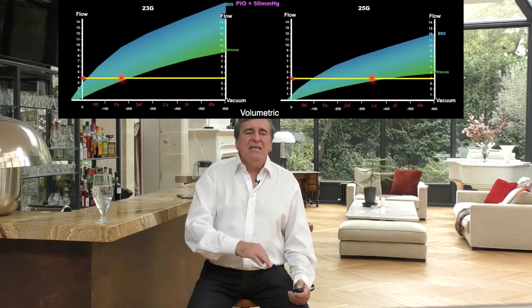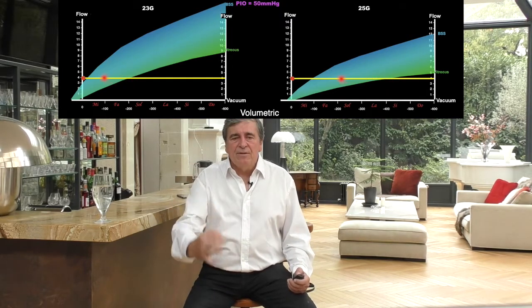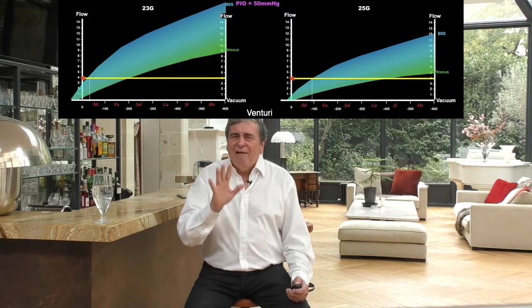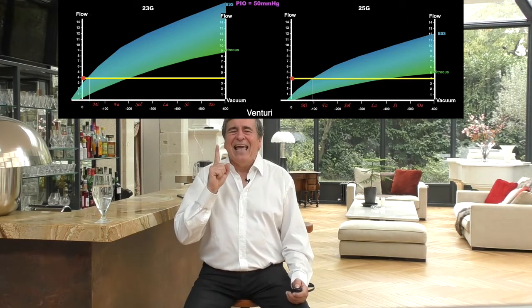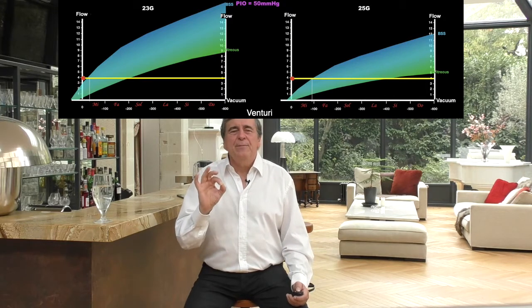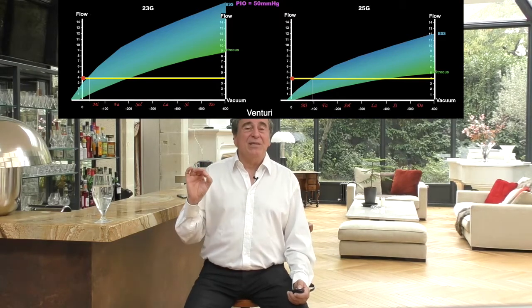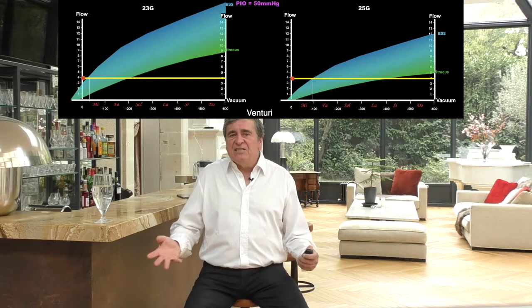Whether it is in BSS or in vitreous, the speed of a fluid entering his handpiece will be the same at 4 cc's per minute, and he will control it. If he works with a venturi pump, he has to have the same flow rate of 4 cc's per minute in the BSS. He must not exceed minus 40 millimeters of mercury in 23 gauge and minus 90 millimeters of mercury in 25 gauge. And he will never work with this vacuum level.